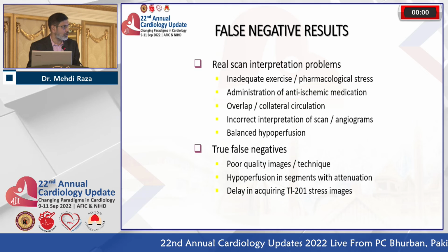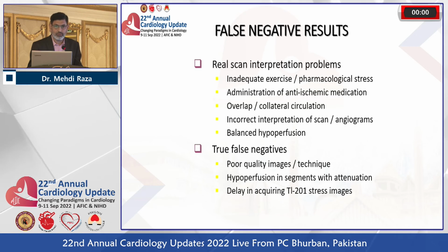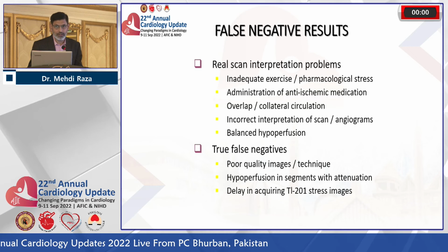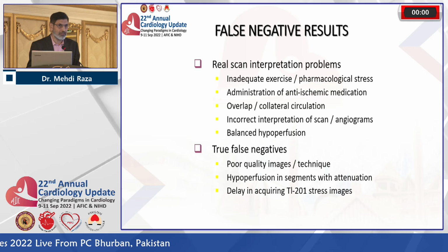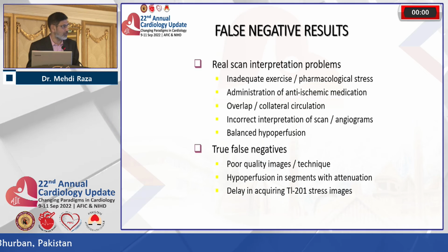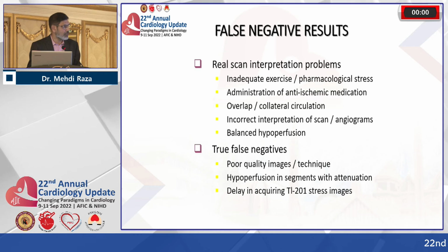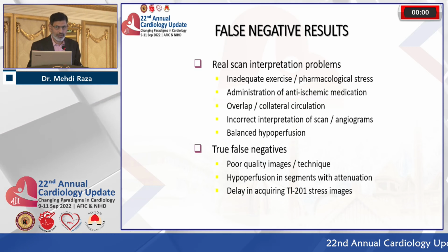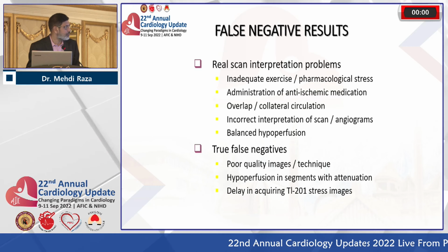Many a time a cardiologist wants the patient to have a scan with the medication, and there are others who want the medication to be stopped. So it is not adequately conveyed to the nuclear cardiologist as we are often doing the scans. We don't know if we have to do the scan without medication or with medication. So most of the time we are stopping the medication and then doing the scan. Especially those who are doing ETT, physical stress, they would like the heart rate to climb, and they ask the patient to stop beta blockers and come for the scan. At least for 24 to 48 hours, they stop the beta blocker.